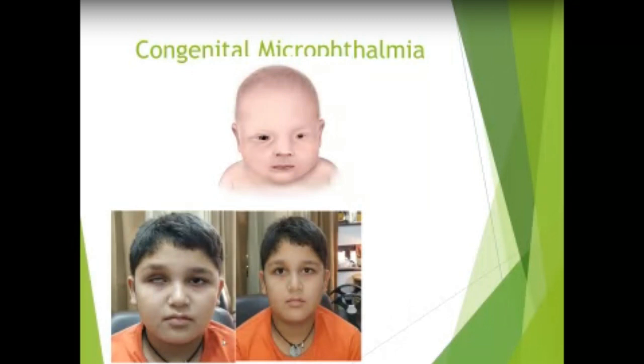The presence of a conformer stimulates orbital and adnexal growth, and a series of conformers increasing in size are fitted over the course of the first year so that normal size and relationship can be maintained. Initially, the conformer needs to be replaced weekly, then monthly, then quarterly at longer intervals, until the socket is finally ready for a more permanent ocular prosthesis.